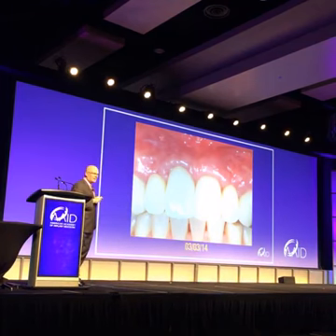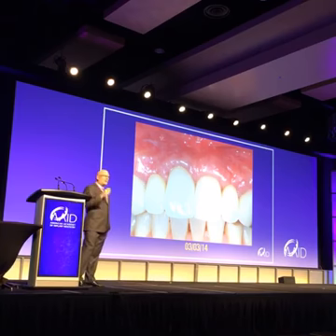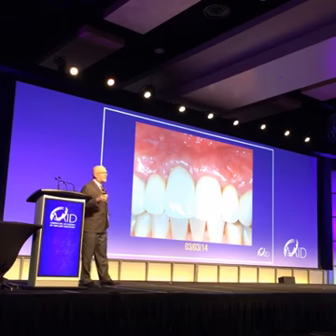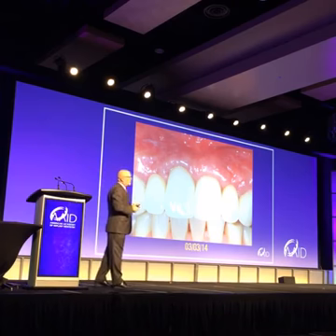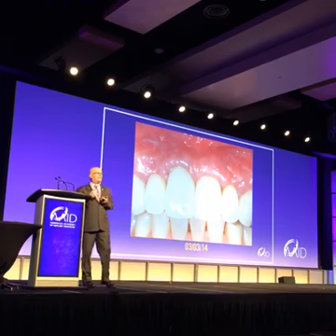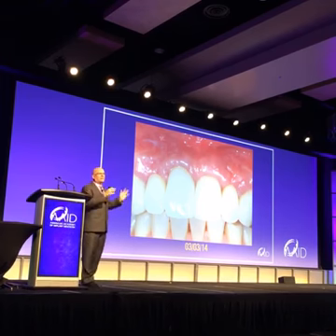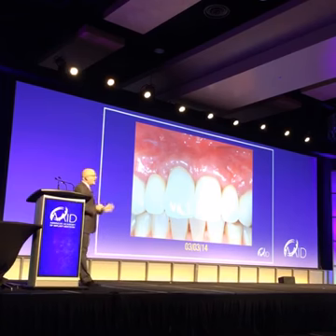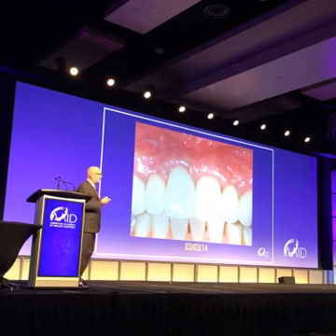There's another anterior case. This was treated the same day it was found by the hygienist. The hygienist saw the patient, saw that there was pus coming out of number 9, and said, Dr. Honigman, come over. I said, yeah, you have an infection, let's get this treated right away. I didn't have to make sure I had bone graft material or the correct membranes, or bring the patient back for full mouth scaling and root planing a month before I was going to treat them, or that I had my biomimetics. I didn't have to make sure anything's right. I just needed to have my laser there and my piezo, and that's all I needed. We treated her that day. It took me probably about 45 minutes, but I take pictures, so that's why it took a little longer than normal.